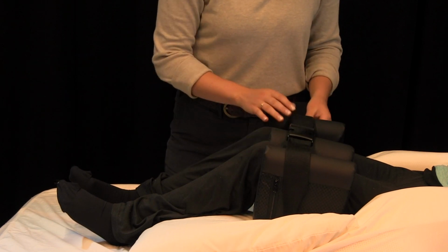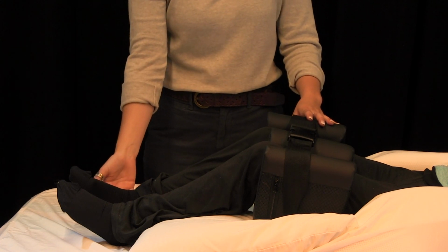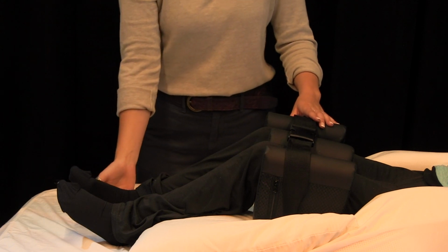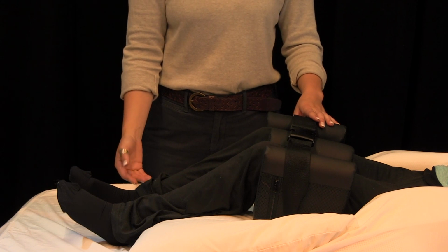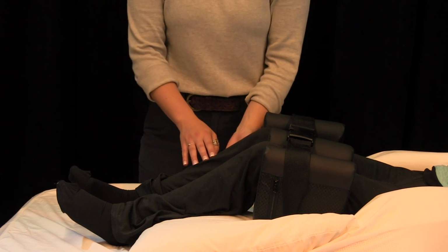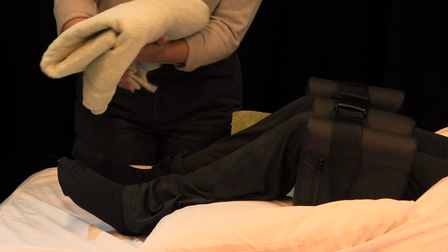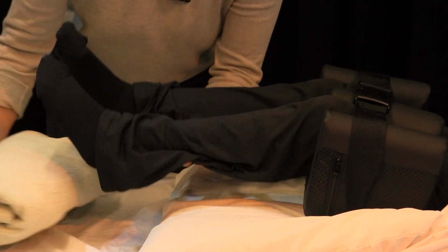This specific support does have a buckle that can be placed around it to ensure that the legs stay in this position. And now we will want to take pressure off of the heels. So always be sure to check the user's heels, as this is a high-risk area for pressure injuries. The aim is to have floating heels. So we'll make sure that some support is added beneath the calves first. We're just gonna use a folded towel here. Do you mind if I lift? No, I don't mind.